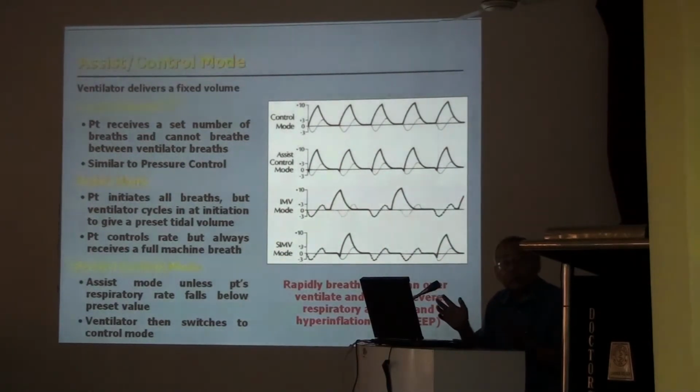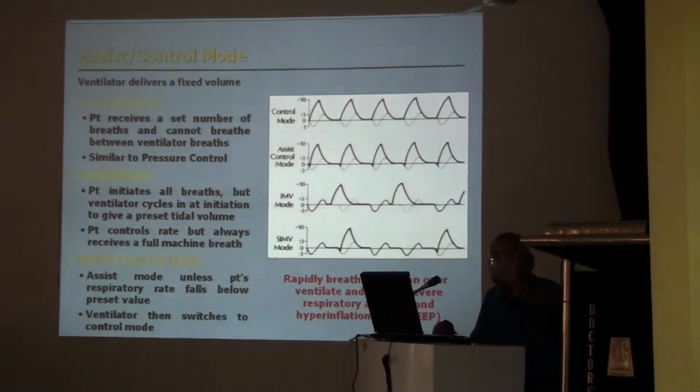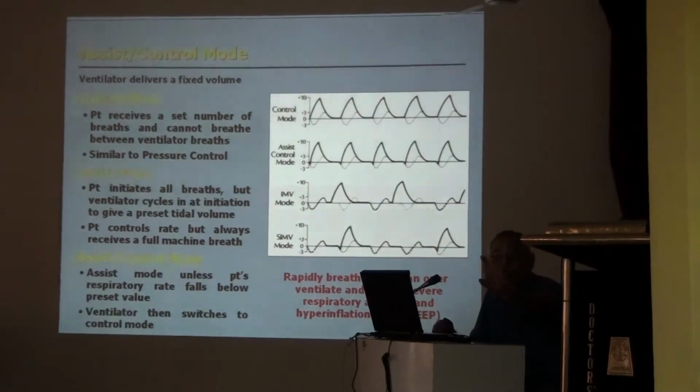Now they have gone back, I again fall asleep, and under the influence of the narcotics, gradually my tidal volumes are falling. What will happen? Now the machine will watch. Still the machine will allow me through the ventilator circuit, and the machine will only deliver the atmosphere, because the machine has a blender inside. You have seen in the first slide, blender inside. If 0.21 is enough, I don't require much oxygen. So room air is enough. The 0.21 FiO2 air is delivered by the machine.